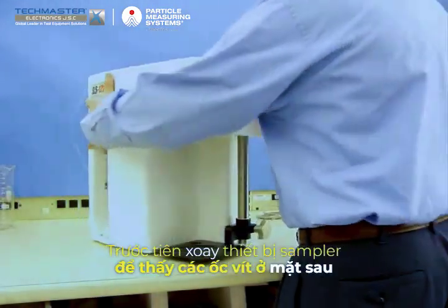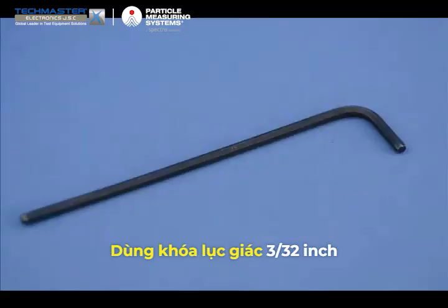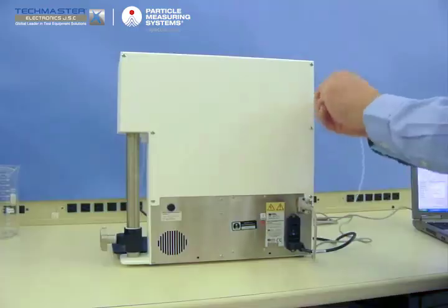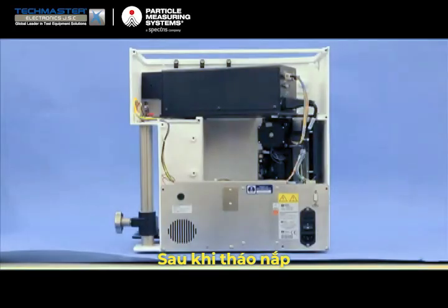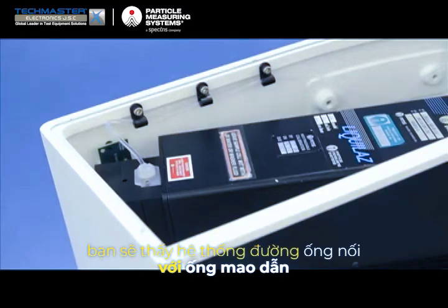Rotate the sampler so that you have access to the rear panel screws and use a 3/32 Allen head wrench to remove each of the 6 button head screws securing the rear panel. Now that the lid has been removed, you will have access to the tubing connecting to the sensor capillary.